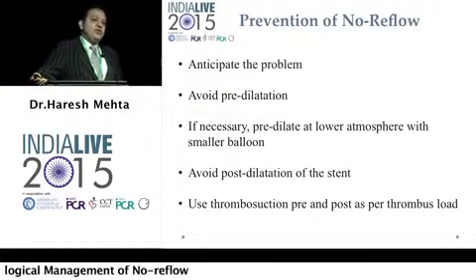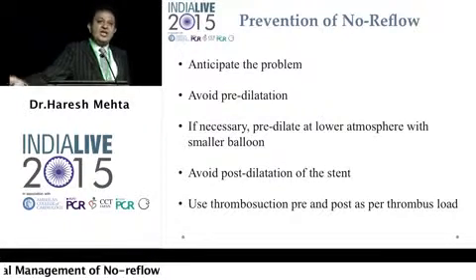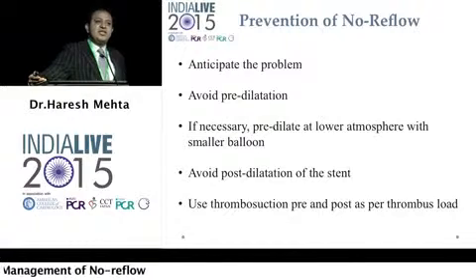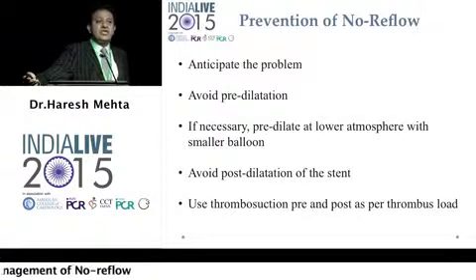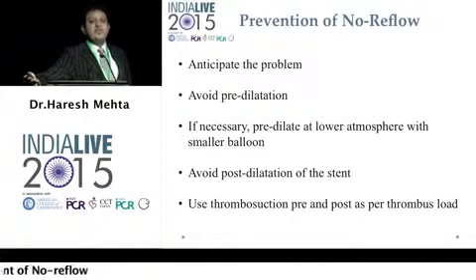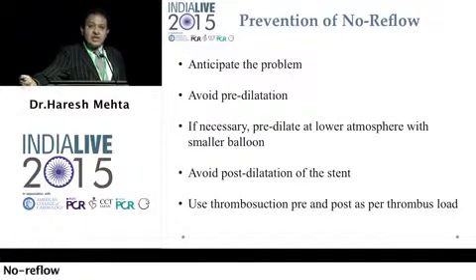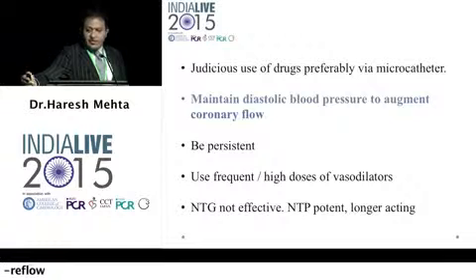If you have taken your thrombus suction catheter below the lesion and take a shot, the reflux of the contrast will tell you how the distal vessel is and might show you a dissection at the distal edge of the stent, which is causing the supposedly no reflow. So your first stent may have caused a distal dissection which is preventing flow. So an injection, or I will show you another technique where you can find out what's happening.